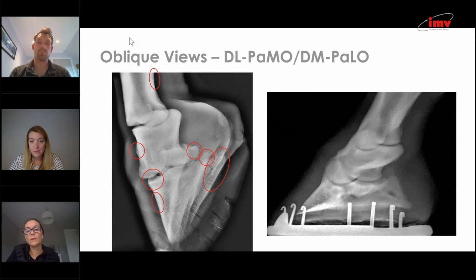And I must say, when I was in practice, it wasn't a standard view that we added in, exactly due to cost and things like that, as the question emphasizes. I think it's very interesting how technology has moved on, so that now, with those subtler lamenesses, they are added in as standard. You can change that protocol at any point, and that might emphasize that maybe it should be part of every foot series.